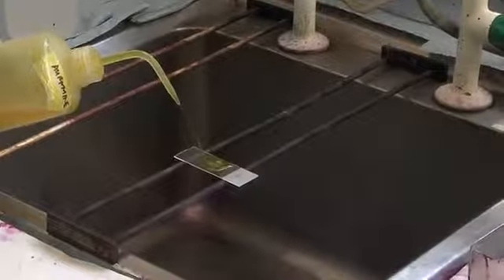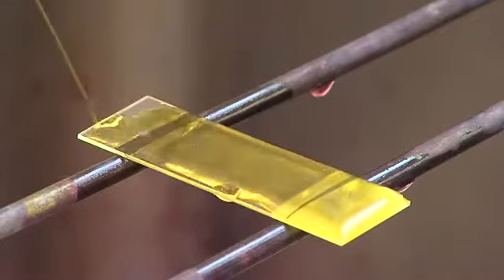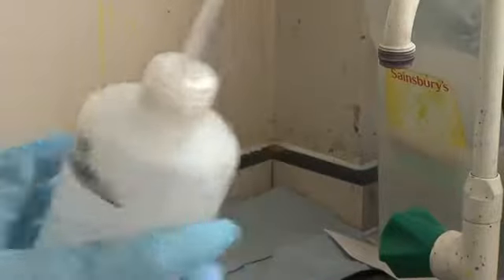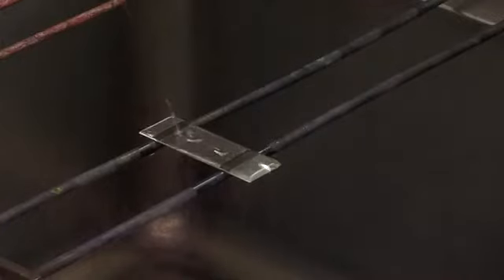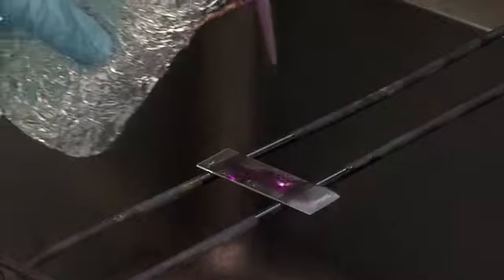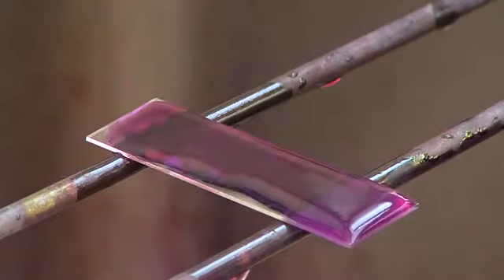The auramine phenol stain procedure involves staining the slide with auramine phenol for 10 minutes, washing with sterile water, and then adding 1% acid alcohol for 5 minutes, and washing again with sterile water. The slide is then counterstained with 0.1% potassium permanganate for 30 seconds. The auramine phenol penetrates the cell wall of the mycobacteria and is not removed when exposed to the acid alcohol. The acid and alcohol fast bacilli then fluoresce yellow-green when examined under a fluorescent microscope at a ×400 magnification.